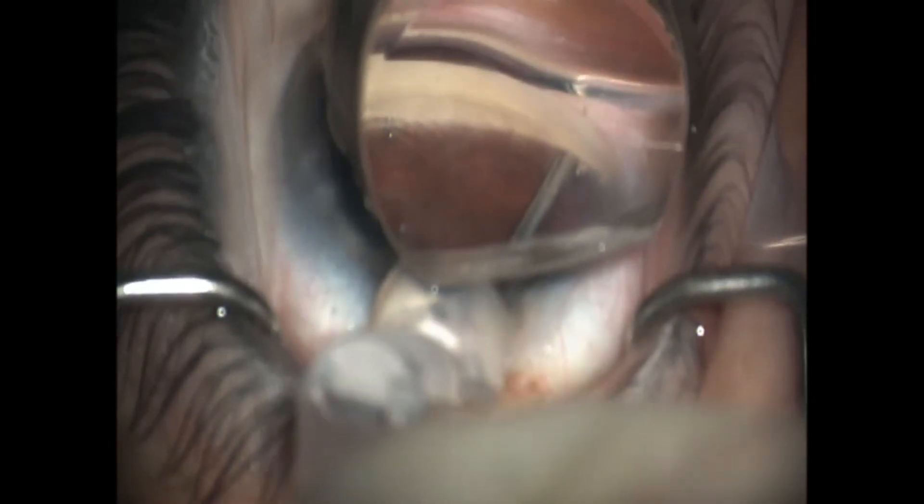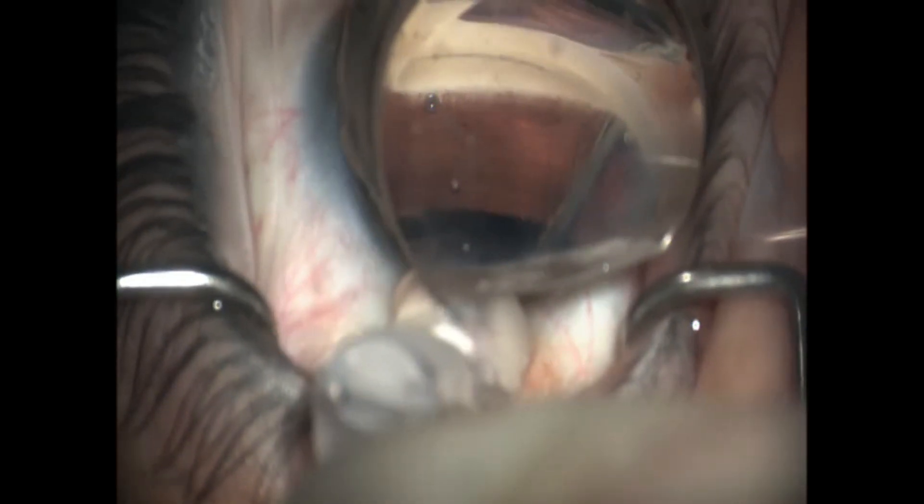What they recommend is your first stent go directly across from where you insert the eye — right there at 12 o'clock — and then they want you to drop one down at 6, or 90 degrees off in both directions. I did the first one at 90 degrees on the left, the second one at 90 degrees on the right. I try to get way off into the periphery.